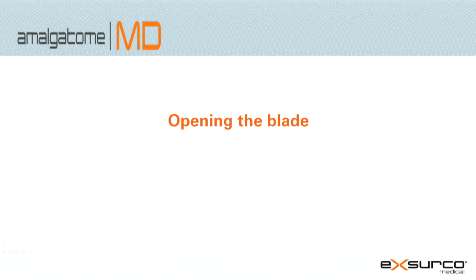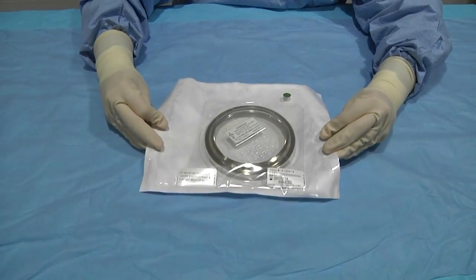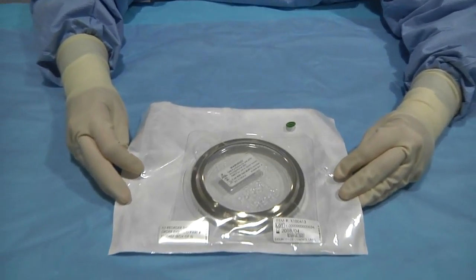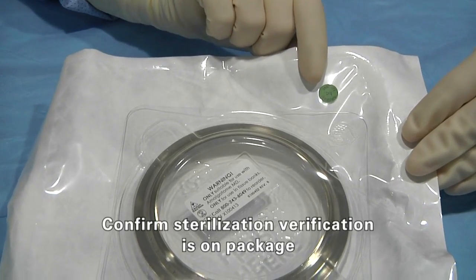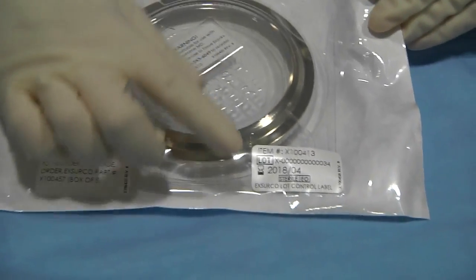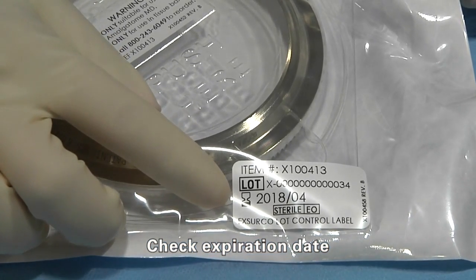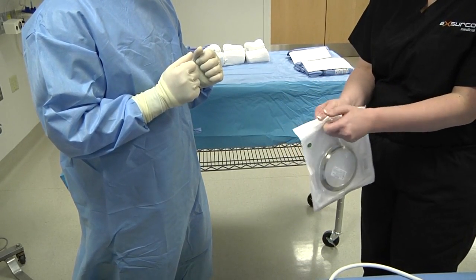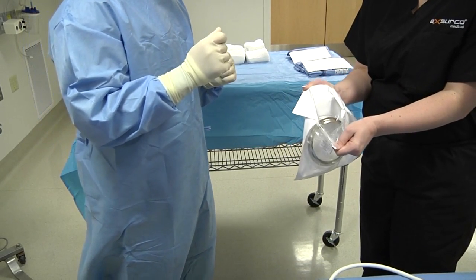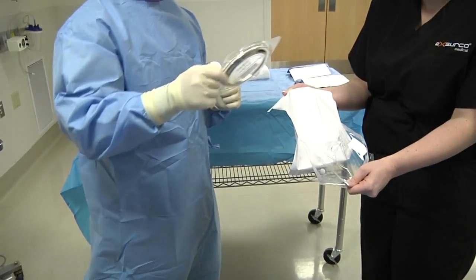Open the blade. Always check the package integrity and expiration date before use. Using the peel pack end with the chevron shape, pull open the packaging, allowing the sterile operator to reach inside and grab the blade.